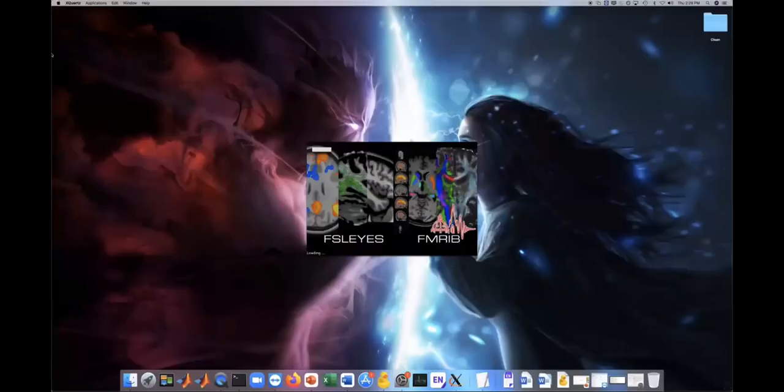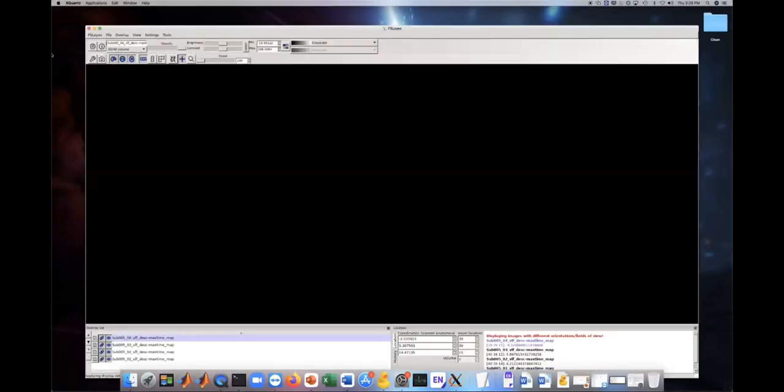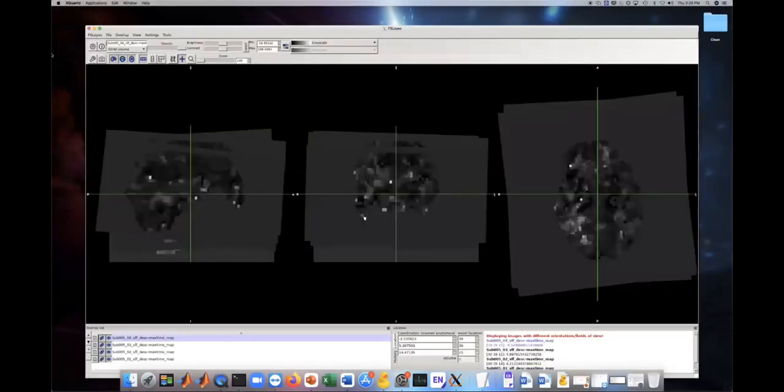So now we go back to the lag maps. Let's compare them more carefully. We can just use FSLeyes again with max time map and a star for the scan numbers. So now we could theoretically look at them on top of each other and compare them, but as you can see, we can't really compare them directly with each other since they are all in native space.